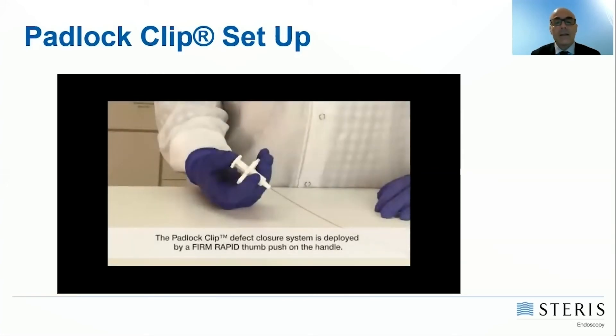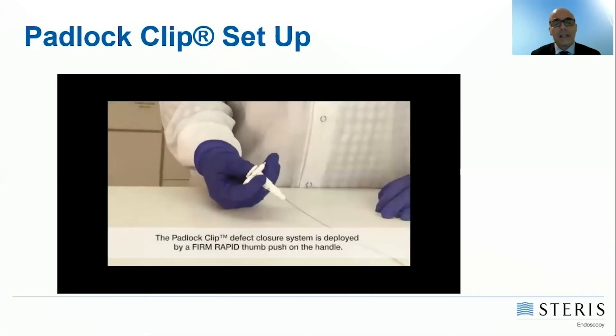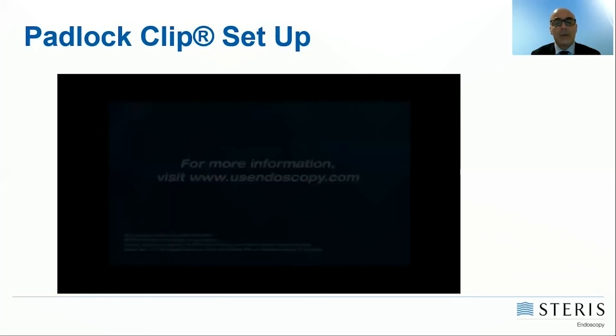This is the way to release the clip. You really need just three fingers. It is very, very easy.